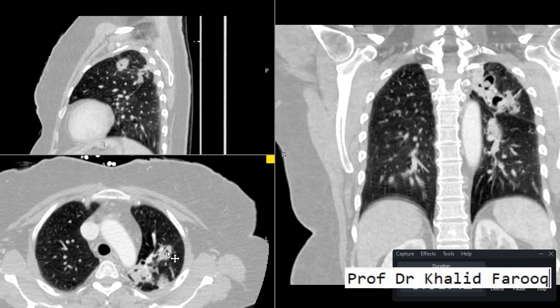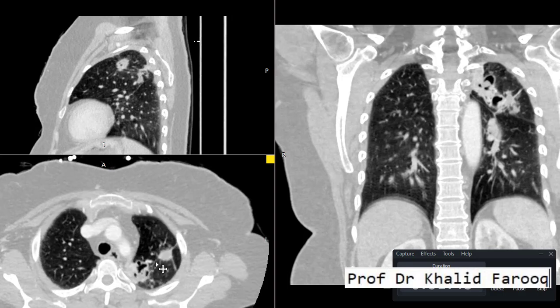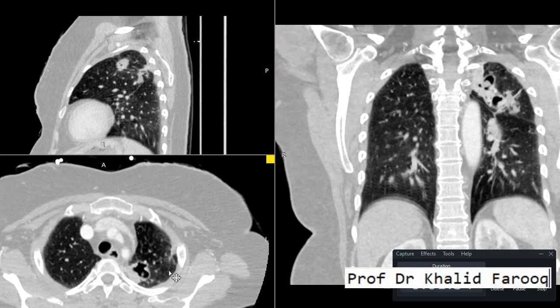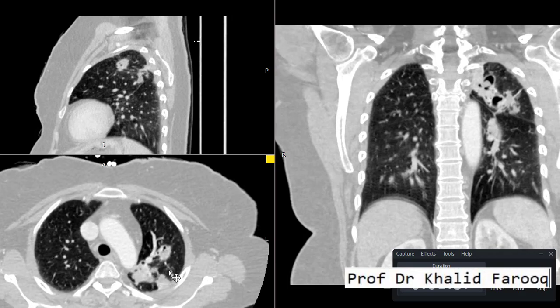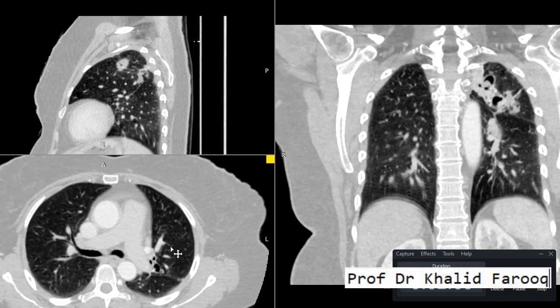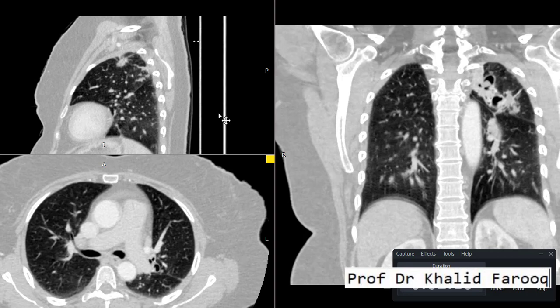Another area of developing cavity is noted in this region, with fibrotic changes around it. There is another cavity with an irregular nodular wall. There are also a few lymph nodes in the anterior mediastinum. The diaphragmatic contours and costophrenic angles are unremarkable.